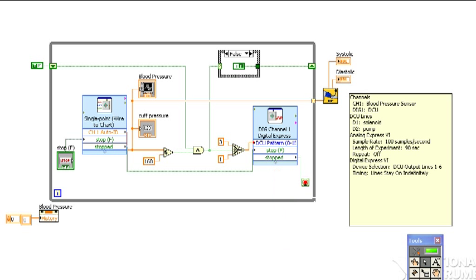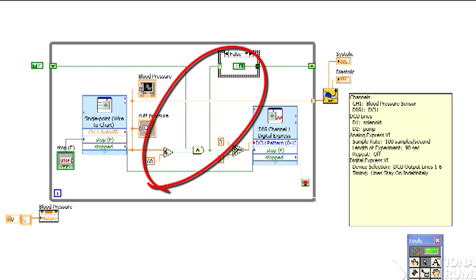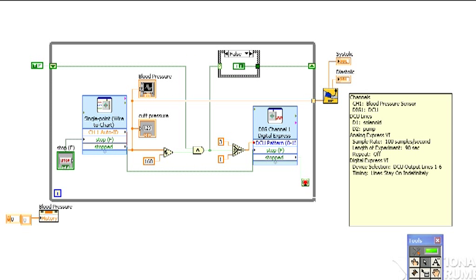The rest of the logic in the loop turns the pump off at 160 millimeters of mercury while leaving the solenoid valve closed until the end of data collection. At this point, the collected data is sent to the blood pressure analysis VI, which does the calculations to determine the systolic and diastolic pressures.